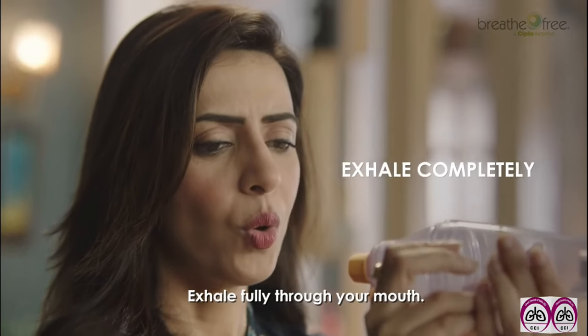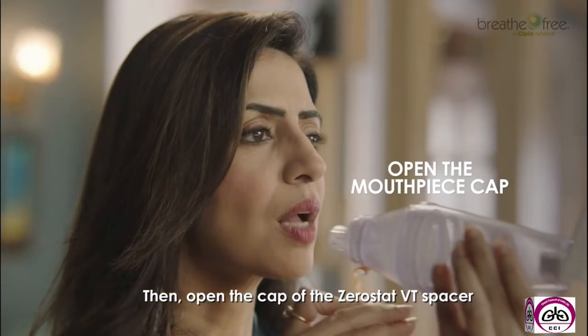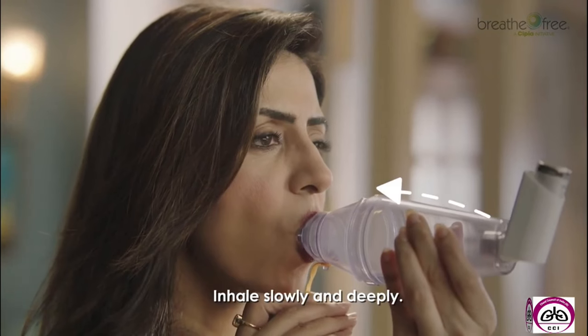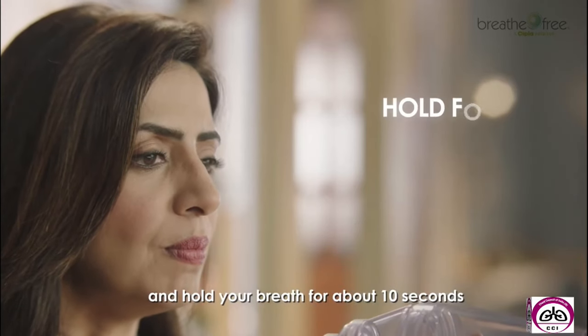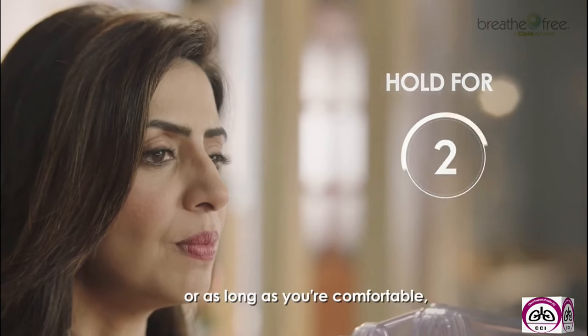Exhale fully through your mouth. Then, open the cap of the Zerostat VT spacer and seal your lips around the mouthpiece without biting it. Inhale slowly and deeply. Remove the Zerostat VT spacer from your mouth and hold your breath for about 10 seconds or as long as you're comfortable.